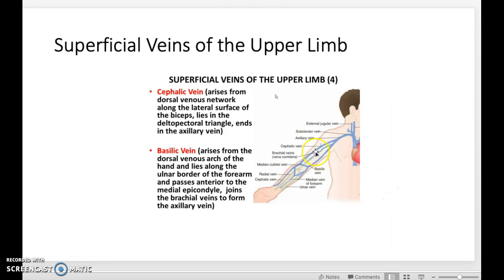Tourniquet. So what you would do to put an IV in: you find your vein, you put the tourniquet 2 to 8 inches above it. You can also put it right over a shirt if it's too painful. You keep the tourniquet tight enough to distend the vein without occluding the arterial flow.